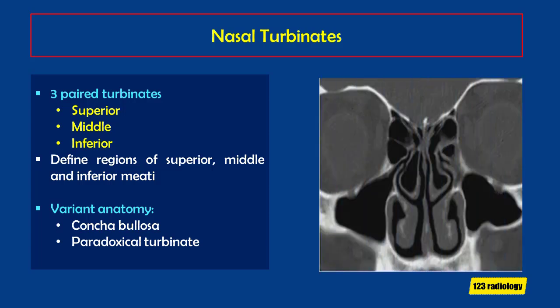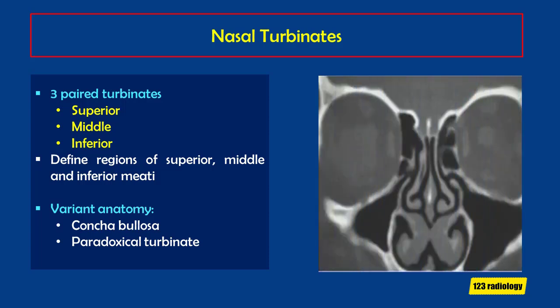We can see some variant anatomy here. One of the most common variants is aeration of the middle turbinate, so-called concha bullosa. We also see another variant called paradoxical curvature of the turbinate, seen as an outward curvature as compared to the normal inward curvature.